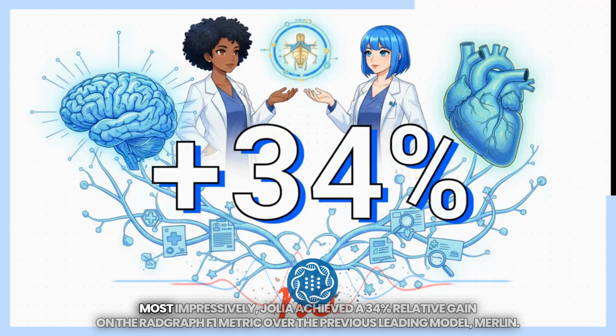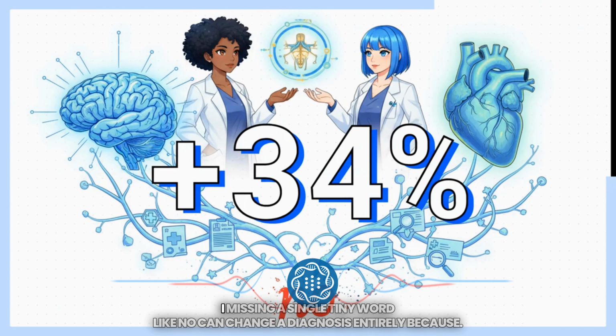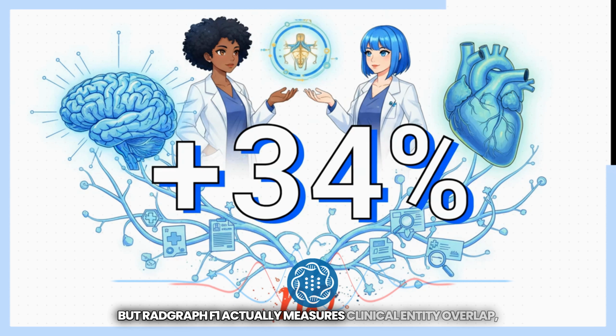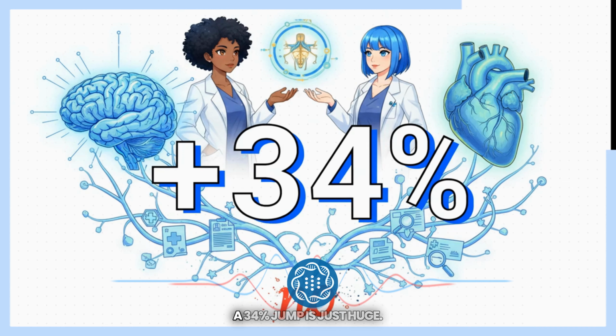And honestly, most impressively, Jolia achieved a 34% relative gain on the RadGraph F1 metric over the previous leading model, Merlin. Standard text metrics can sometimes miss the mark in medicine. I mean, missing a single tiny word like "no" can change a diagnosis entirely. But RadGraph F1 actually measures clinical entity overlap, meaning Jolia has a vastly superior grasp of identifying and accurately stating the correct medical entities in its reports. A 34% jump is just huge.